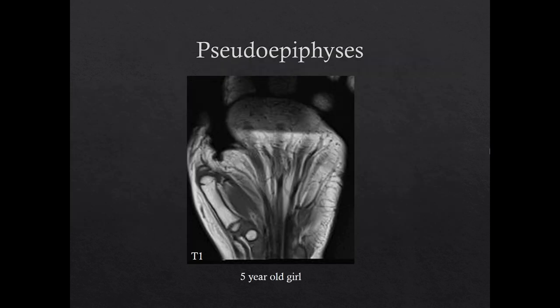Finally, a normal variant which may be seen in the hands and feet is the pseudoepiphysis, which is an accessory epiphysis. The metacarpals and metatarsals typically grow from only one end. In the case of the first metacarpal, the epiphysis is seen at the proximal end. A pseudoepiphysis may be seen at the non-growing end and often fuses earlier, where a notch or cleft may be seen.